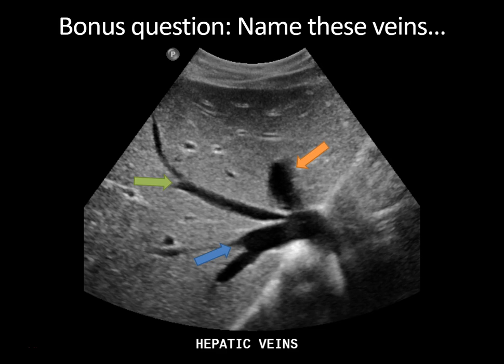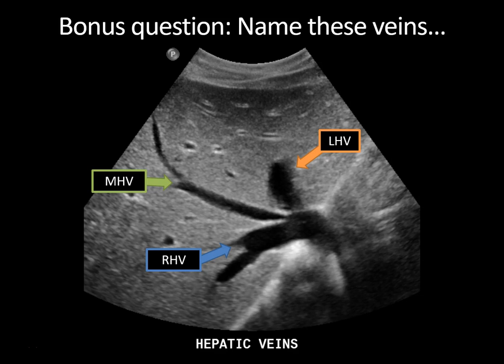Bonus question: can you name these veins? We're looking at a transverse view of the liver with the inferior vena cava visible. This would be the right hepatic vein, the middle hepatic vein, and the left hepatic vein. This is a nice view to obtain when doing an ultrasound of the liver because it divides the liver into different segments at this level — segment seven, segment eight, segment four A, and segment two. The hepatic veins at this level are superior to the level of the portal veins.